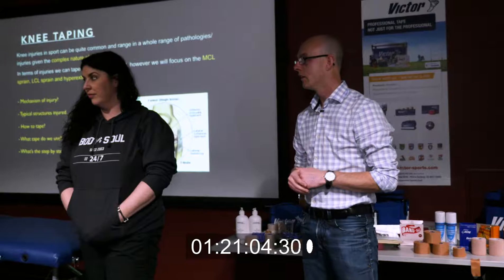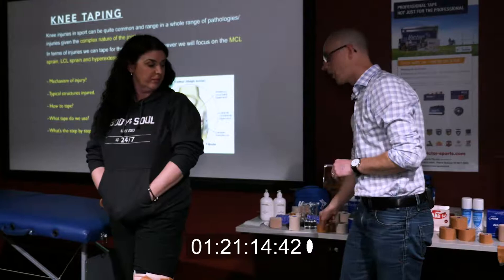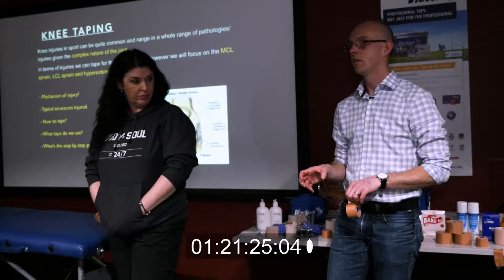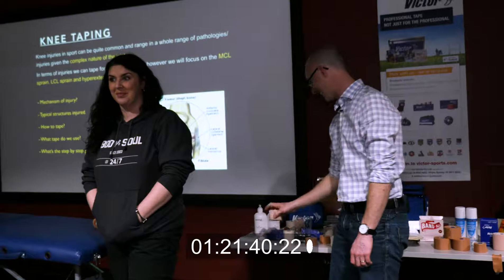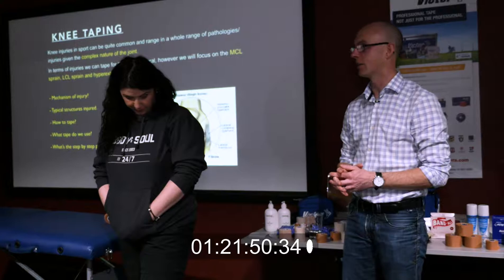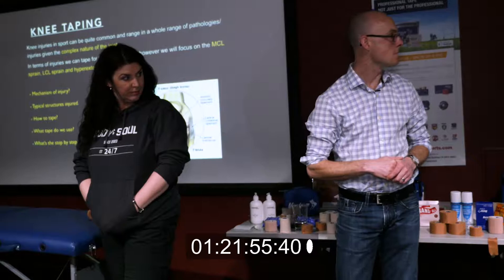You have the hypoallergenic stuff underneath as a sort of anchor — do you not put another rigid anchor in there? No. The reason, from experience and personal choice, is that if you wrap rigidly all the way around the quad, it's actually quite restrictive. That's why even with the anchor we don't go all the way around. If you want it super neat, you'd put a clean anchor around and then repeat. But realistically you're going to over-wrap it and no one's going to see it. As long as it's functionally doing what it's supposed to do — it's more comfortable than a rigid anchor and probably sticks better. You might then wrap a rigid anchor over the top of the stretch.